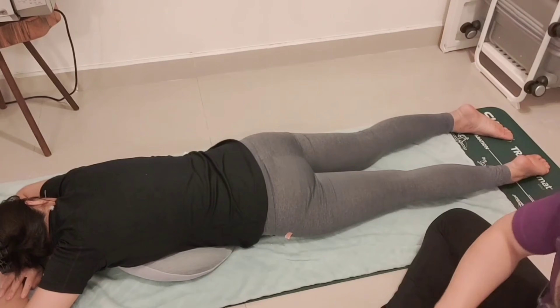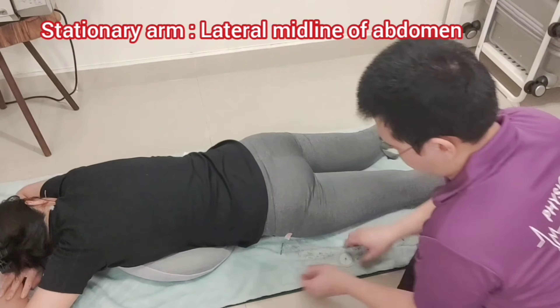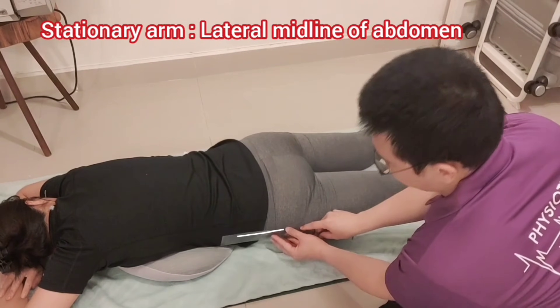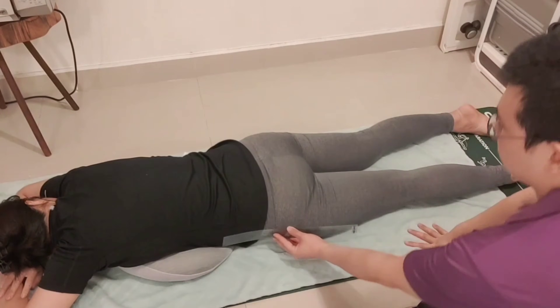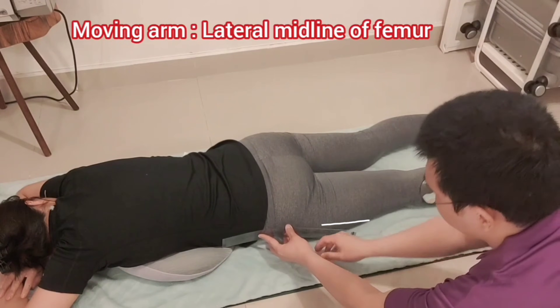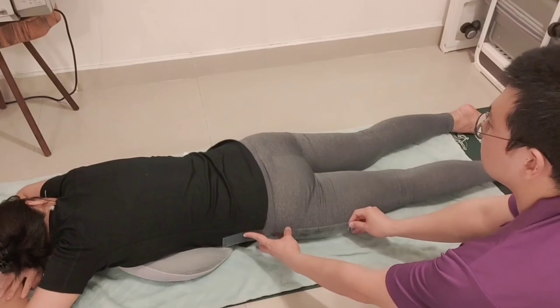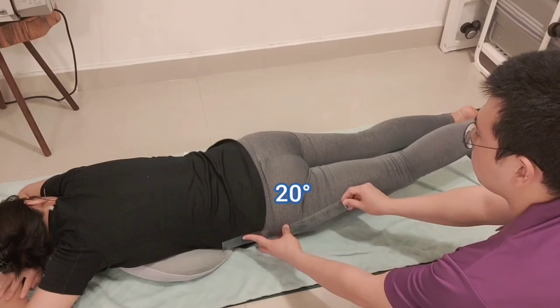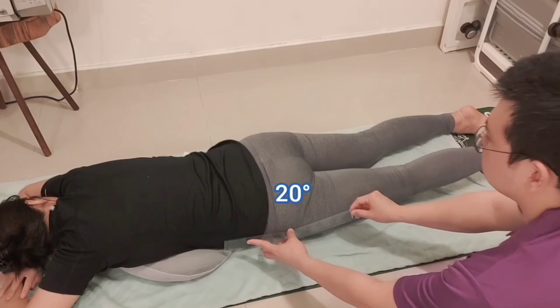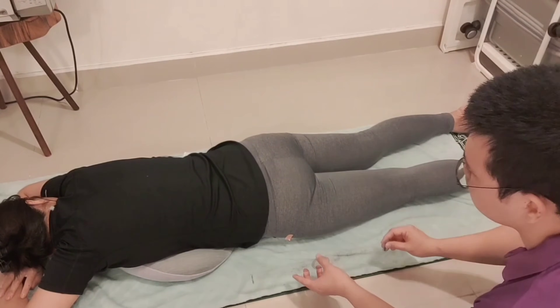A pillow underneath the abdomen can stabilize the pelvis during the measurement. The stationary arm is going to be the lateral midline of the abdomen or pelvis, and the moving arm is going to be the lateral midline of the femur. Now ask the patient to do the hip extension and measure. Read the goniometer and record the measurement.